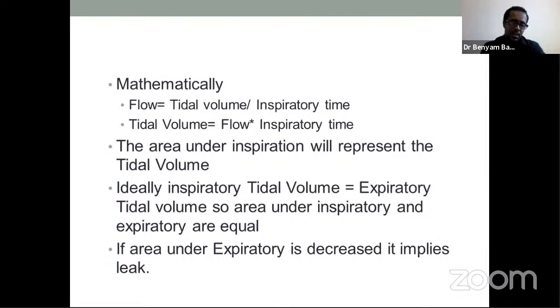The area under inspiration will be represented by the tidal volume, and what we gave should come out. Ideally, inspiratory tidal volume and expiratory tidal volume should be equal. So if there is any reason that decreases the expiratory area, which implies the expiratory tidal volume, there is a leak. So this is another way of knowing there is a leak.